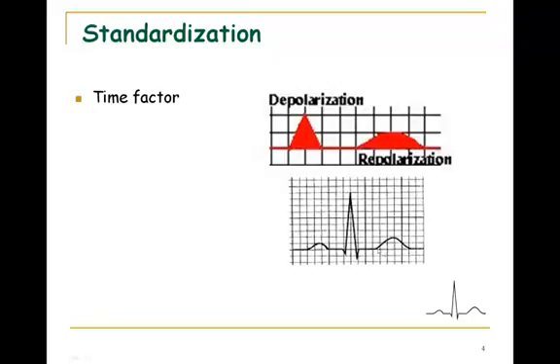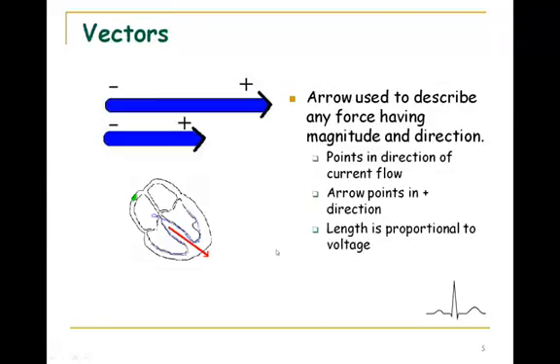So you'll notice this waveform is a little bit wider, and the maximum voltage that you see in the vertical axis isn't as large. But if you measured the area in these curves, they would actually be equal. Now, we had to hand draw these, so it may not be exactly so, but the overall voltage, or the area under these curves, would be the same. But how deflected these waveforms are is, in part, determined by timing.